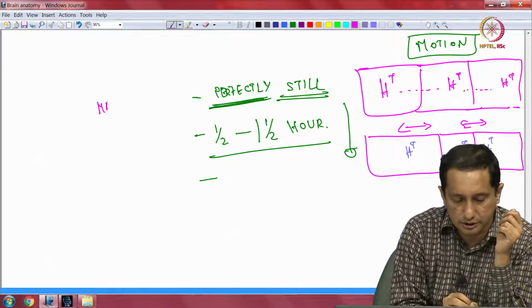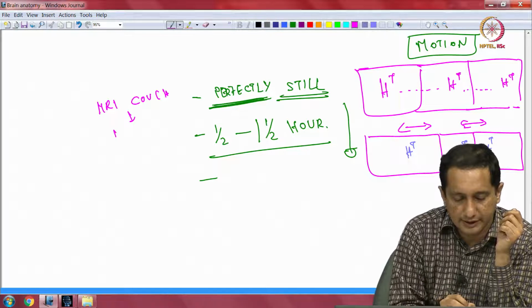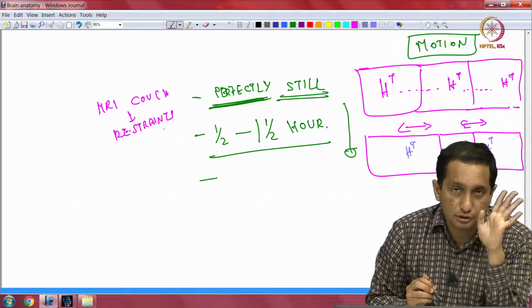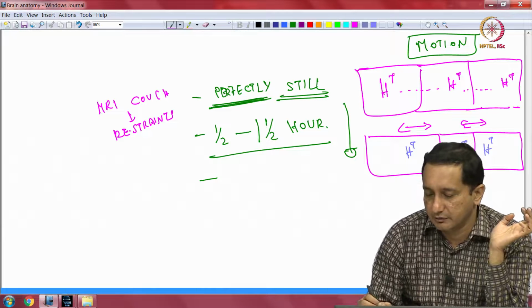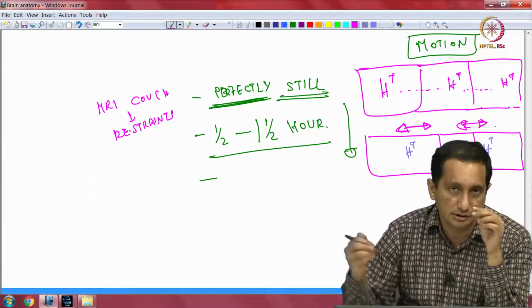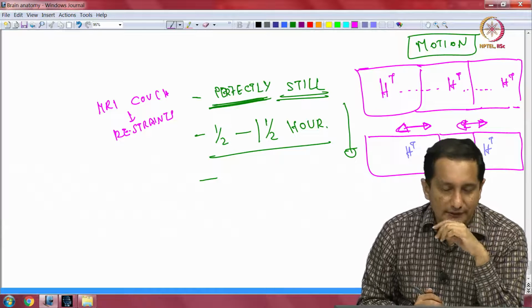the MR couch has restraints. Yeah, and it all looks quite rosy. But remember, what kind of distances are we speaking of? We are speaking of distances between two hydrogen ions. Now, where does maximum movement happen with the body?